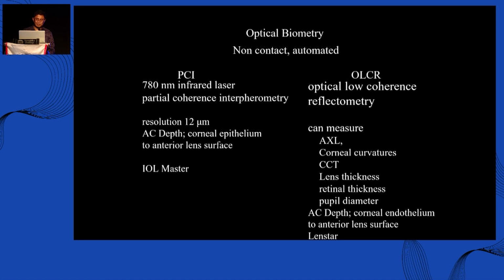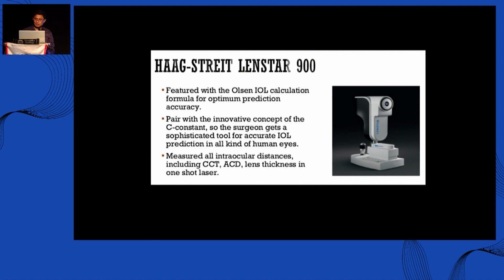And the typical example would be Lenstar. I don't know whether we have it in Sri Lanka. The Lenstar uses something called the thick lens formula. I hope those who did optics must know the thin lens formula and thick lens formula.